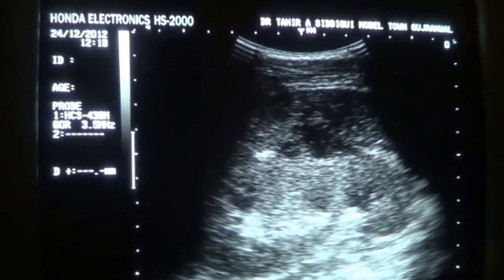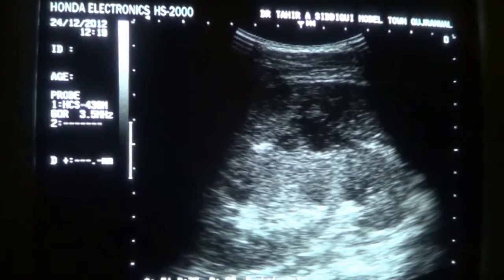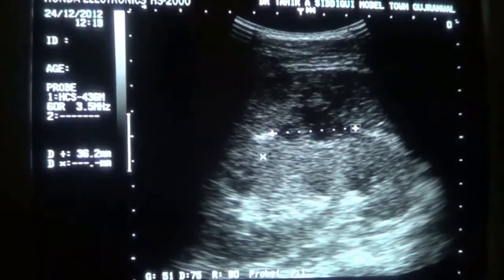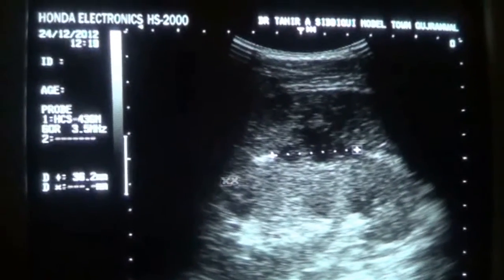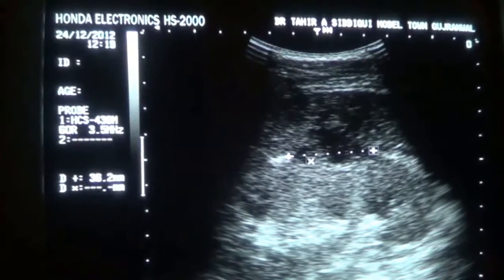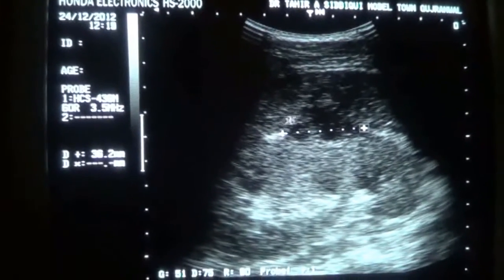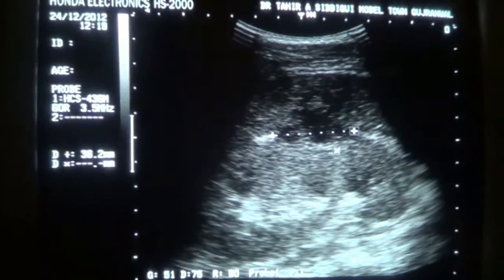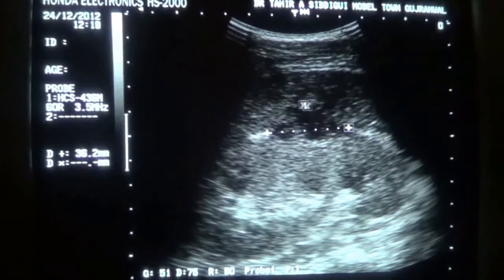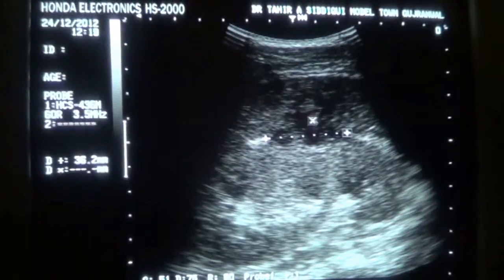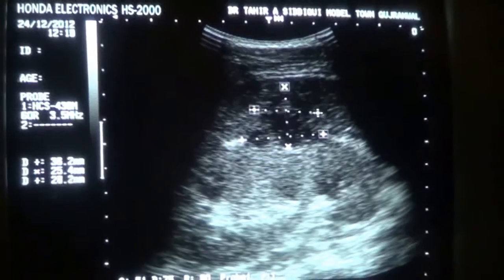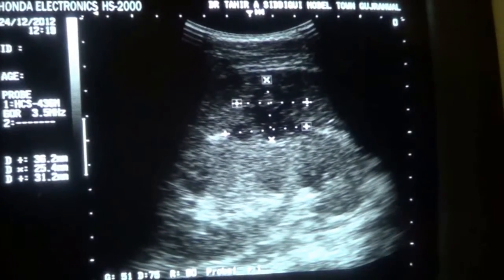There is a breach in this area. This is the capsule at the lower pole, the capsule at the upper pole and mid region. This area is irregularly outlined, internally cystic with internal echogenic areas and no calcification, which is suggestive of focal pyelonephritis or lobar nephronia.